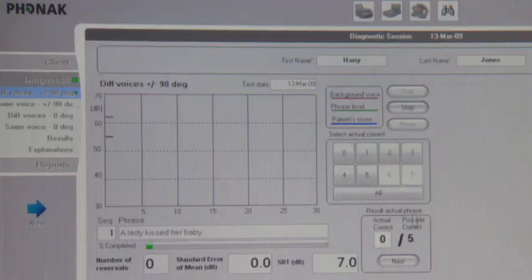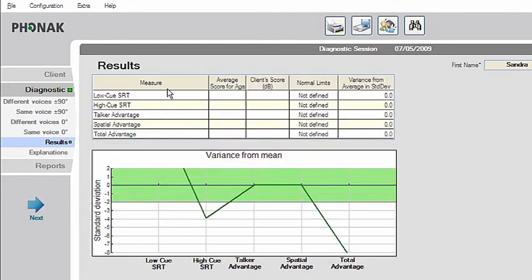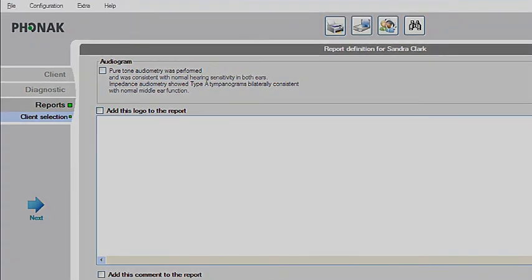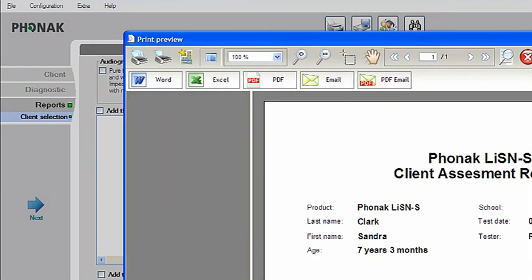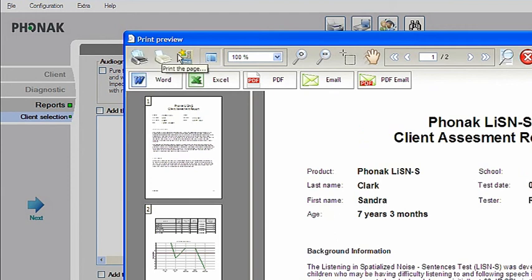After working through Listen S's four test conditions, you'll land on the results screen. This provides a concise overview of your client's performance. For each of the five scores that Listen S measures — the low and high Q SRT and spatial, talker and total advantage — you will see average scores for normally performing children of the same age as your client, plus your client's score for these five measures, details of whether your client is within or outside normal limits, and how many standard deviations your client differs from the mean.